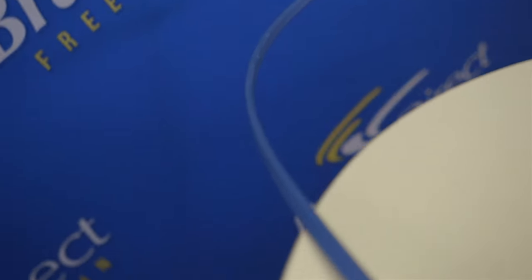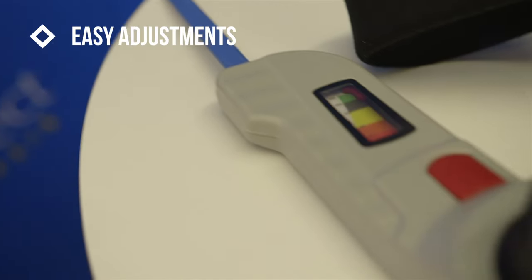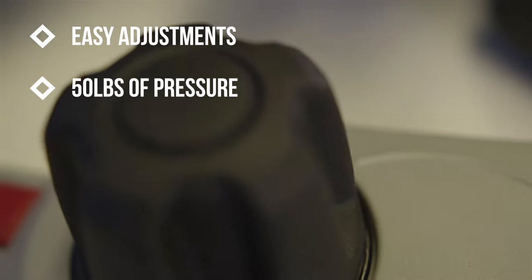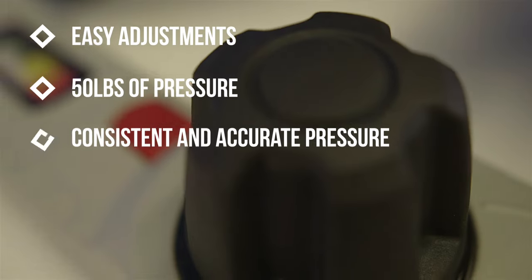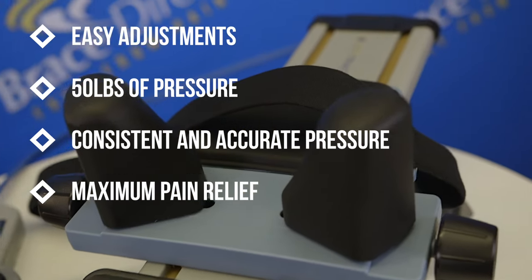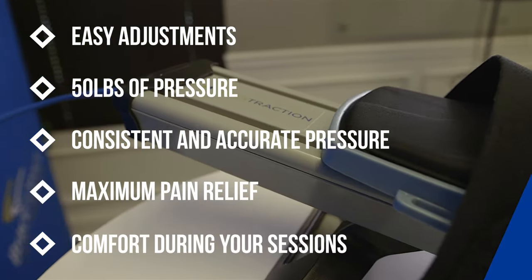The Servit Traction's direct cable technology allows for easy adjustments with just a few clicks of the dial for up to 50 pounds of pressure. The direct cable technology gives you consistent and accurate pressure, allowing for maximum pain relief. Servit Traction's padded head and neck area gives you comfort during your sessions.